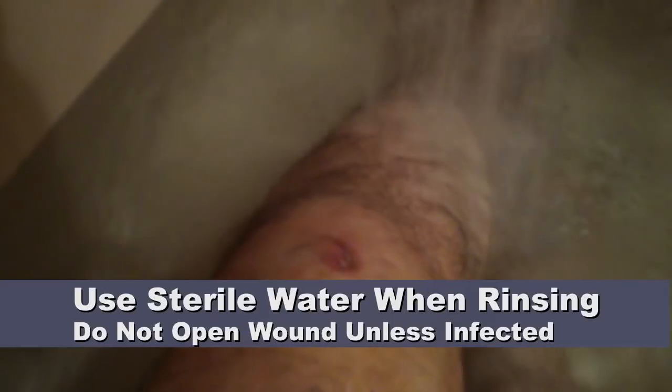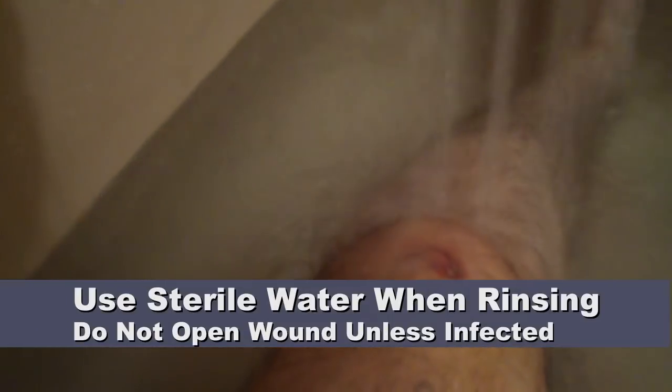So what we're going to do is we're going to irrigate this with just good old-fashioned normal water. Now I'm going to dry the wound using sterile gauze just to make sure that I can get good adhesion with the next bandage.